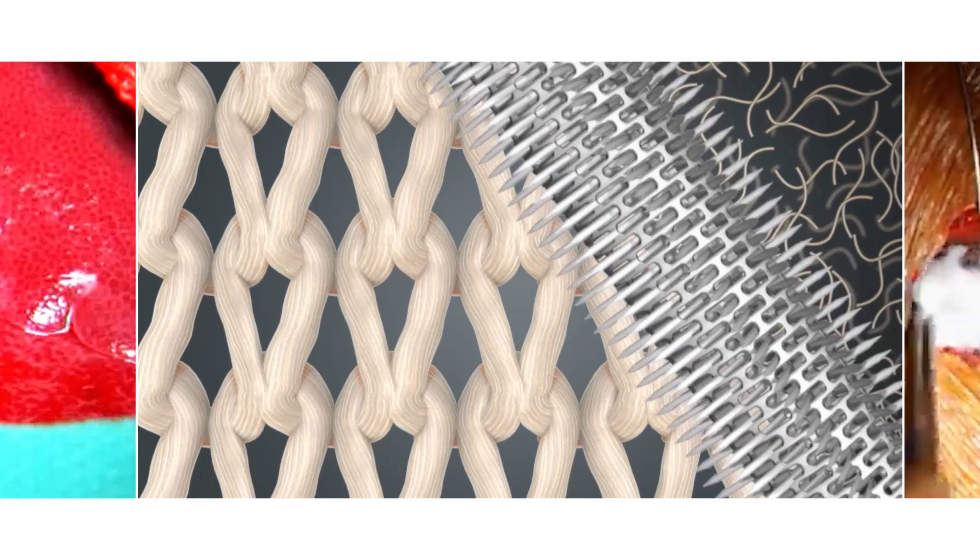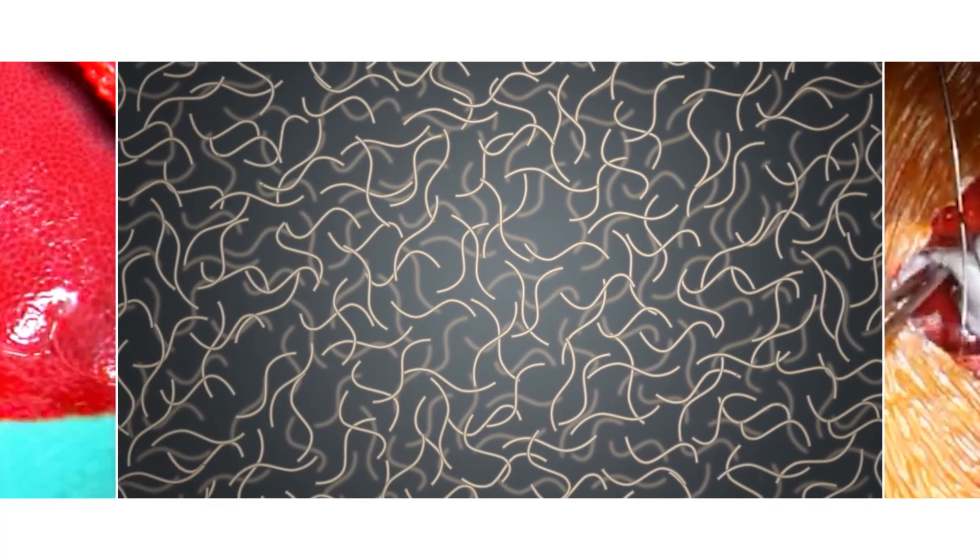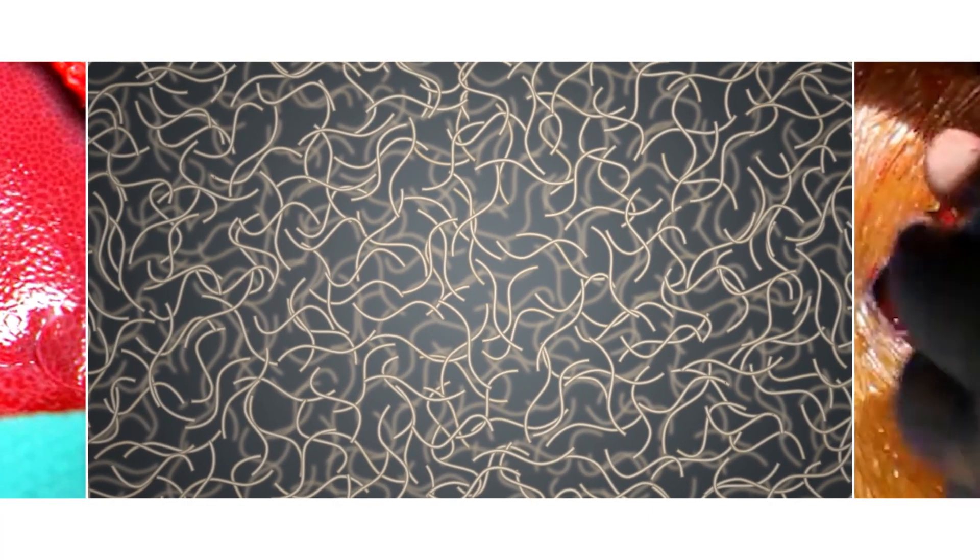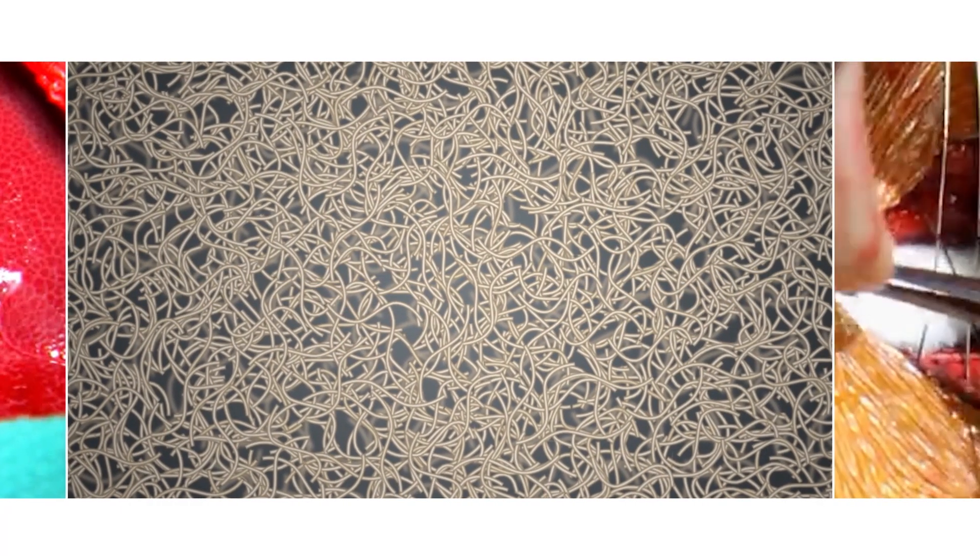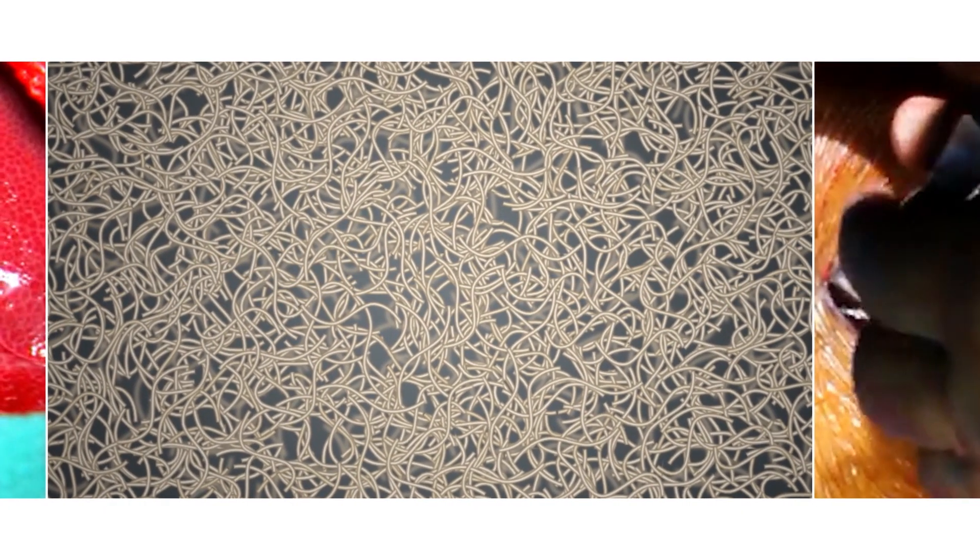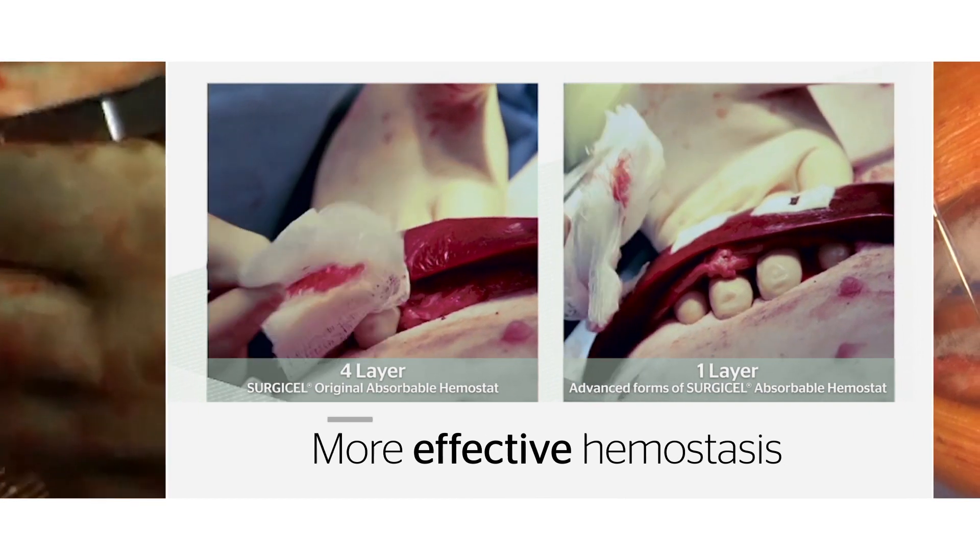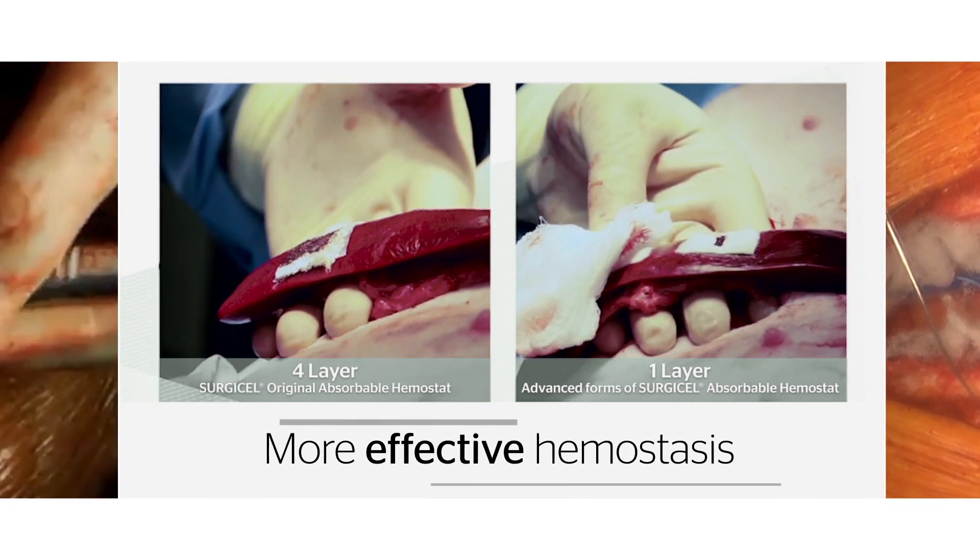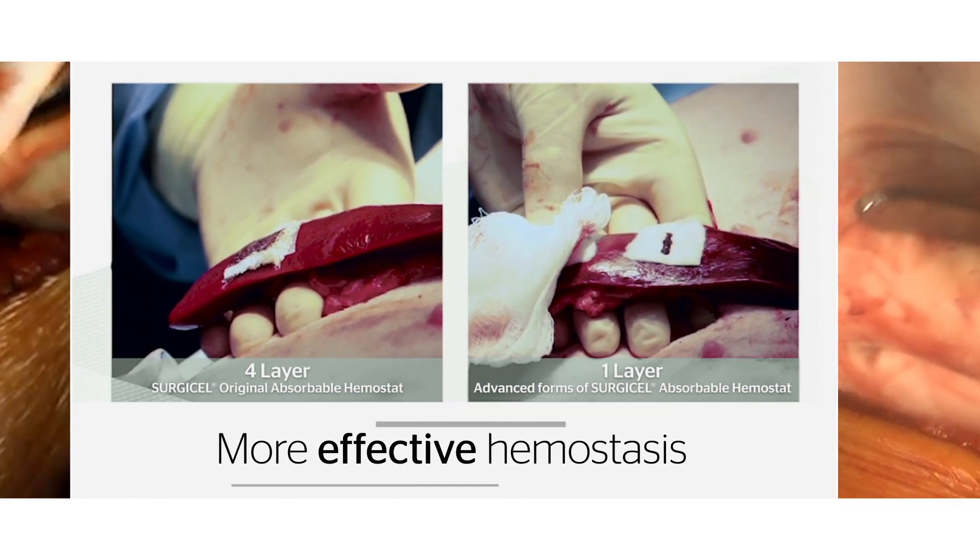These fibers are then used to create non-woven materials with substantially more ORC per unit area. With more ORC available to affect hemostasis, just one layer of Surgicel Snow or Surgicel Fibrilar is more effective than four layers of Surgicel Original.